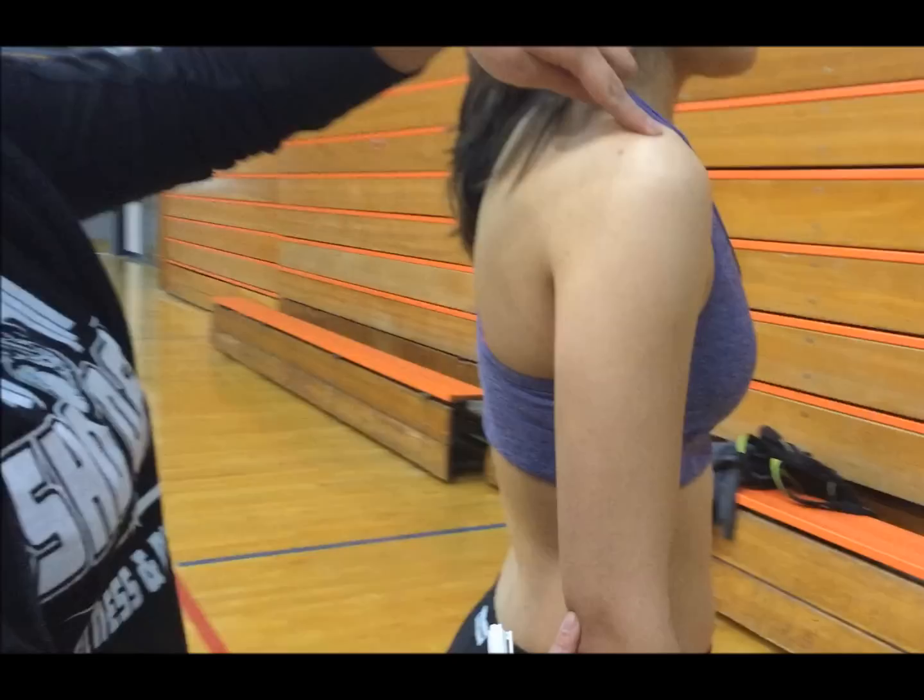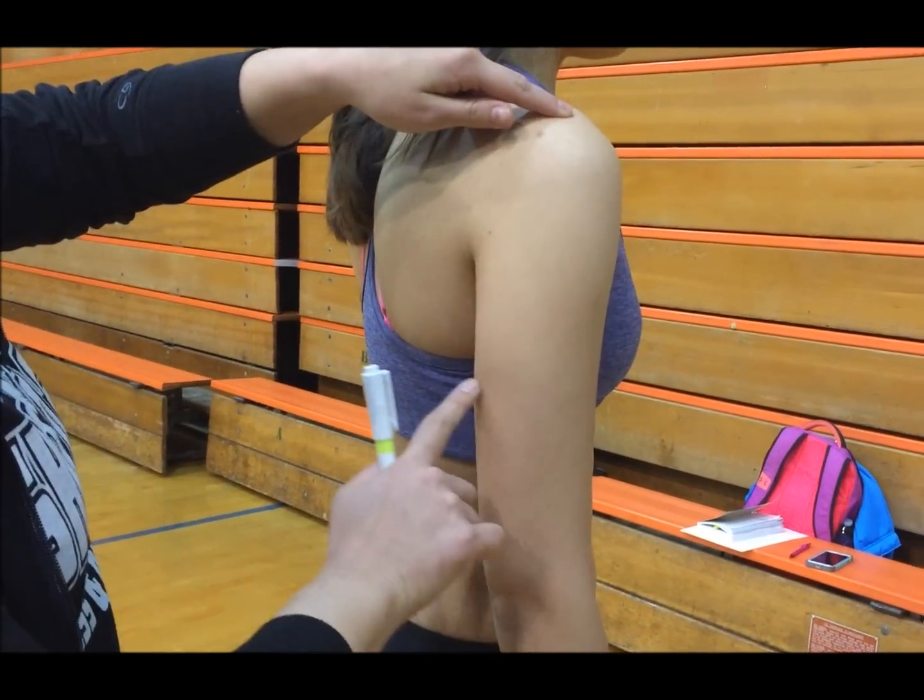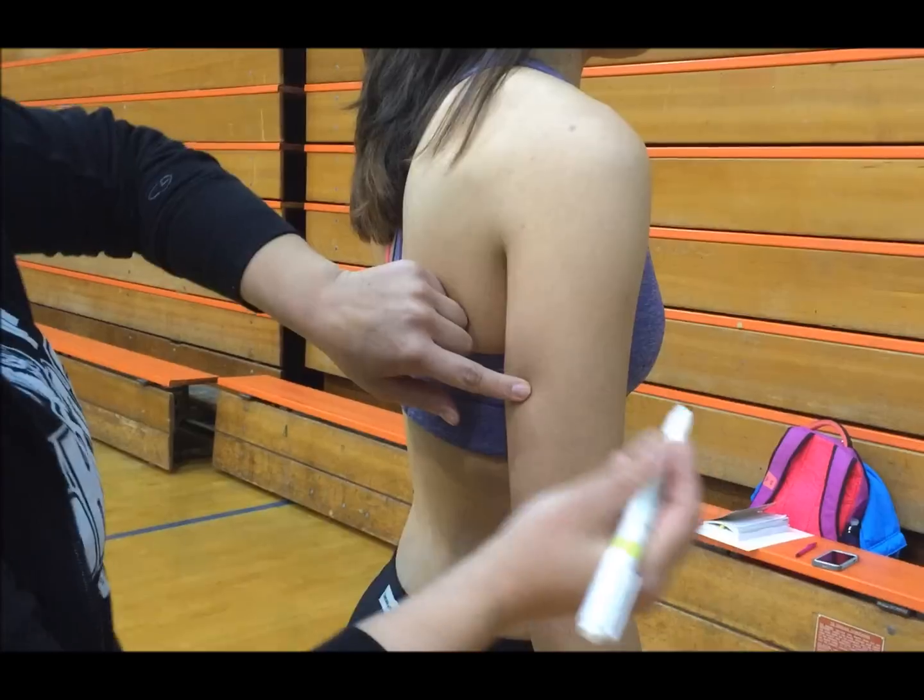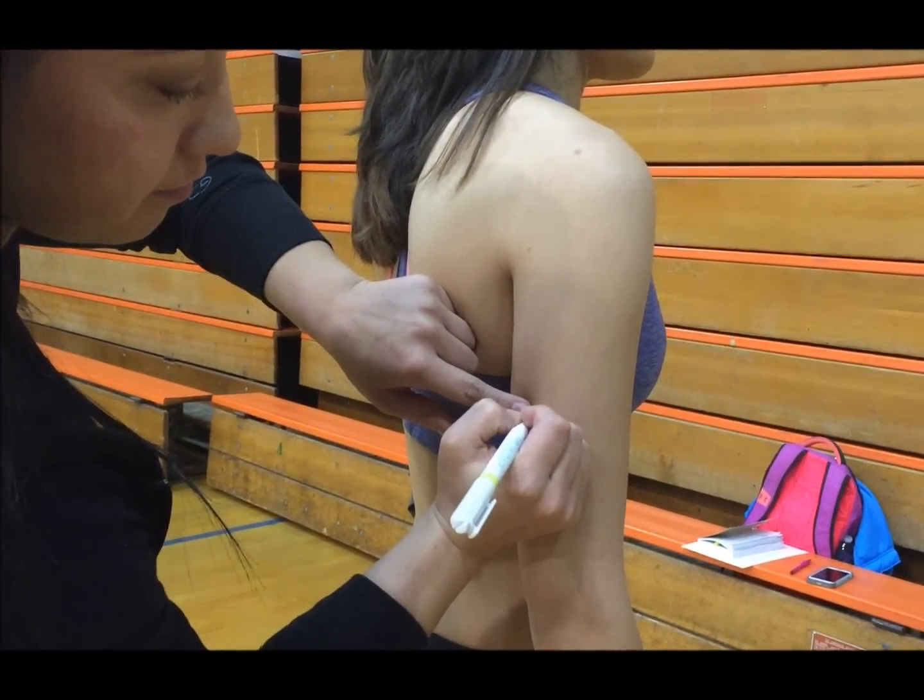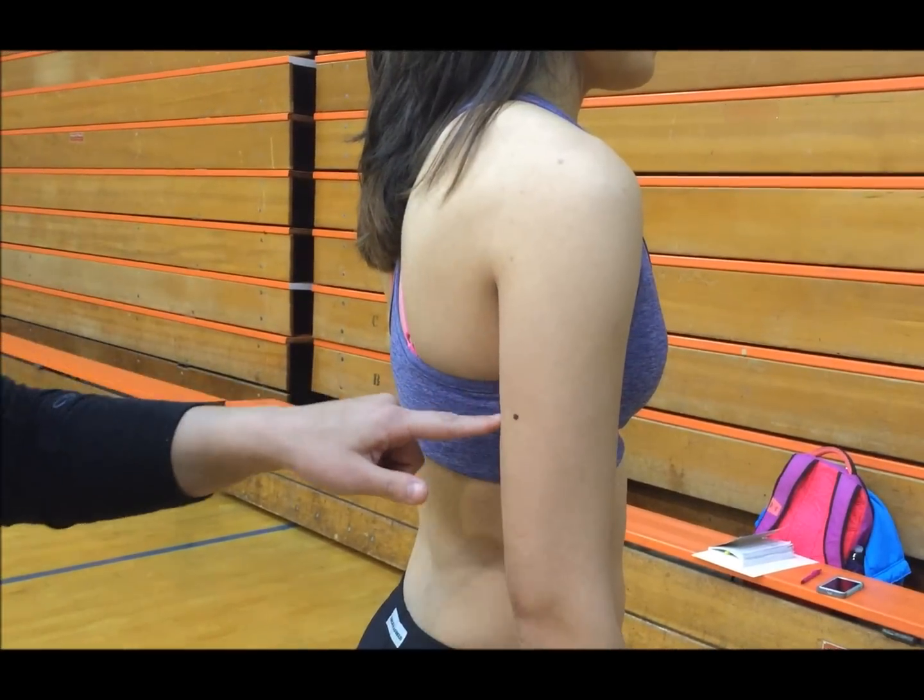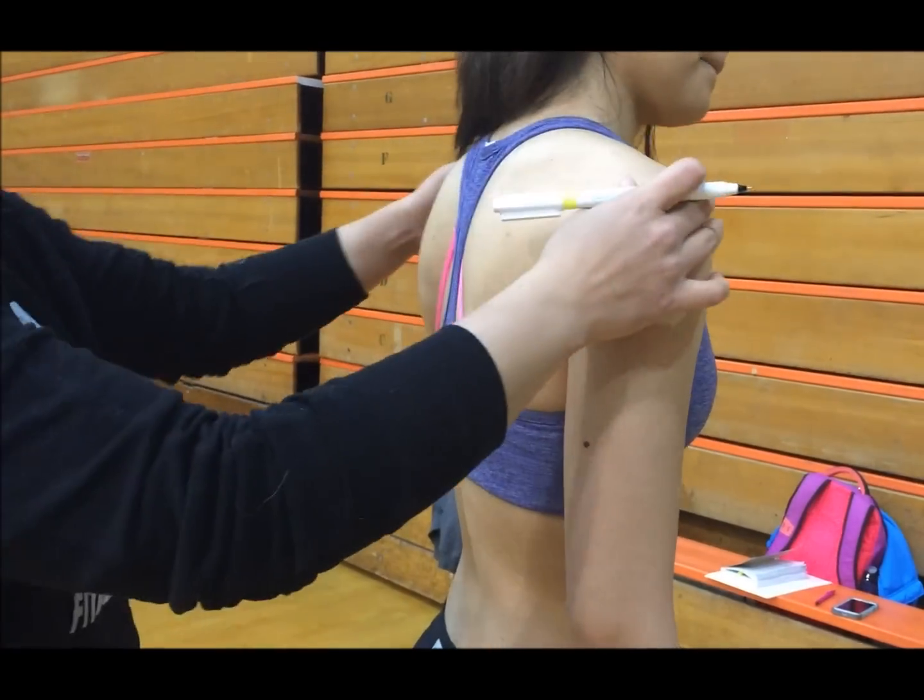The tricep area is a posterior midline of the upper arm, halfway between the acromion process at the shoulder and the olecranon process at the elbow. The arm is held freely at the side of the body and will be a vertical fold.